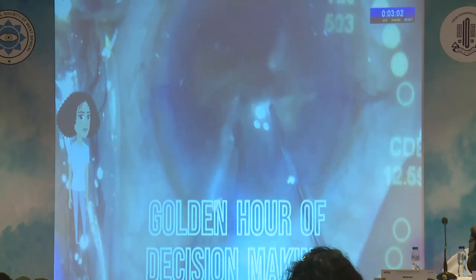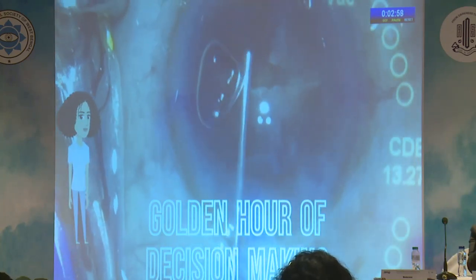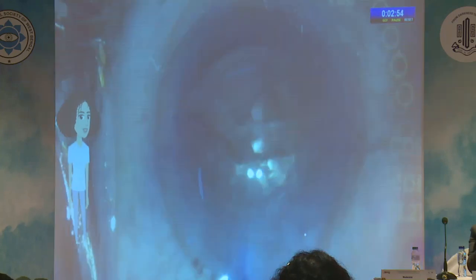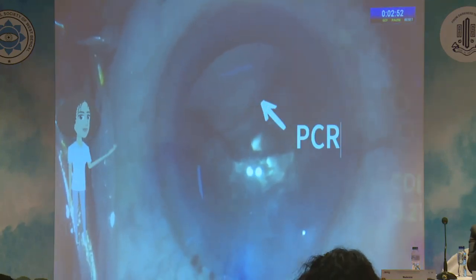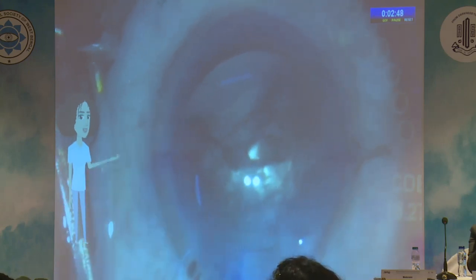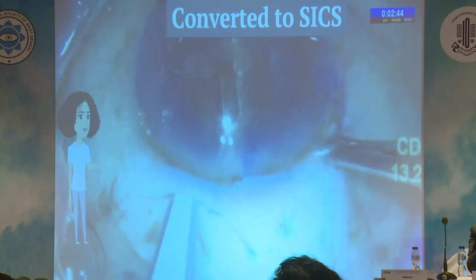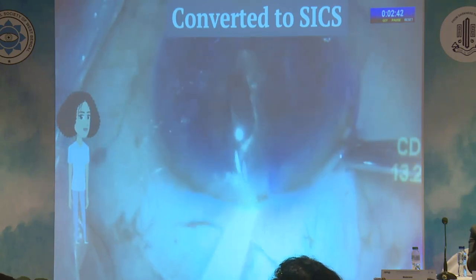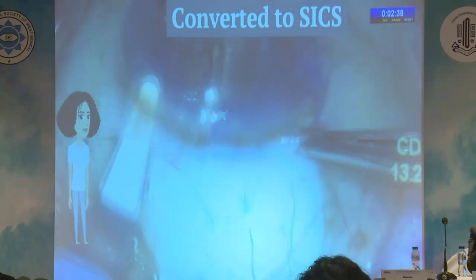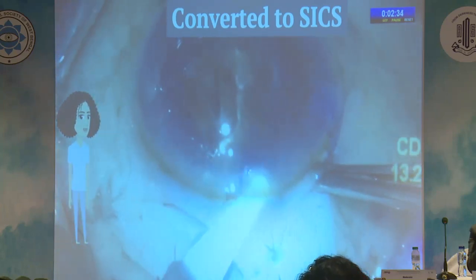He stops and reassesses the situation. He identifies the presence of a PCR, and he promptly converts the case to a small incision cataract surgery and completes the case successfully. Due to the surgeon's vigilance during surgery and promptness in decision making, he prevents a larger complication.